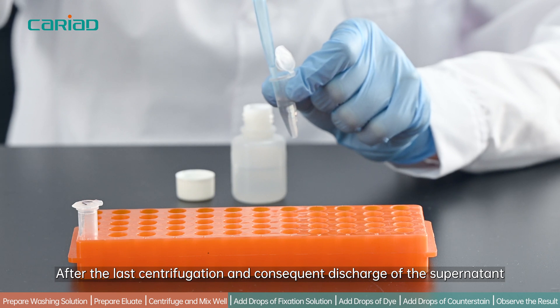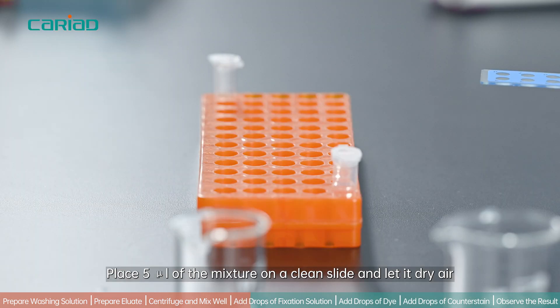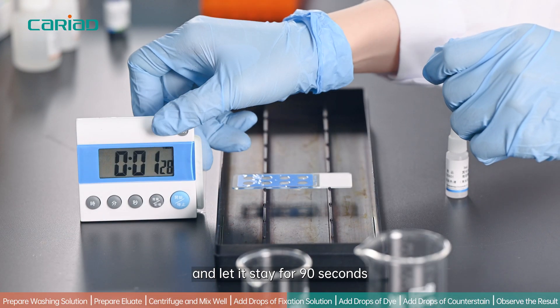After the last centrifugation and consequent discharge of the supernatant, add 1 ml of the adhesive fluid. Place 5 μl of the mixture on a clean slide and let it air dry. Add some drops of the fixation solution on the smear on the slide and let it stay for 90 seconds.